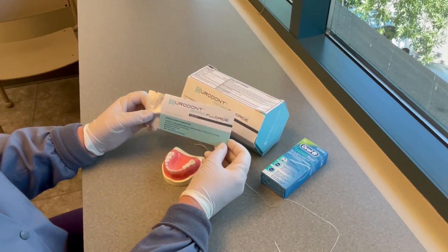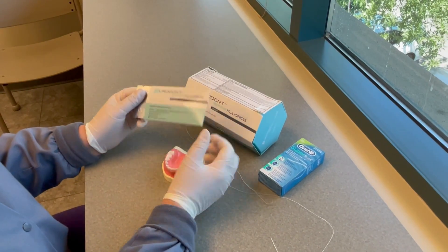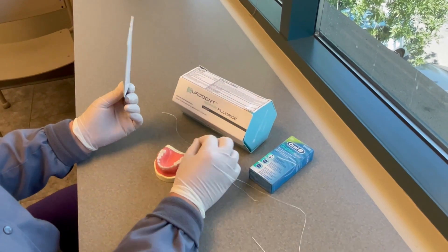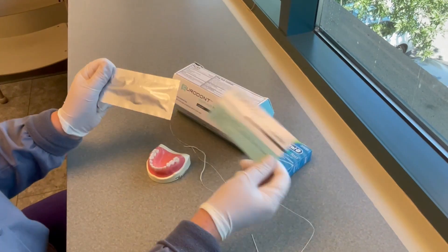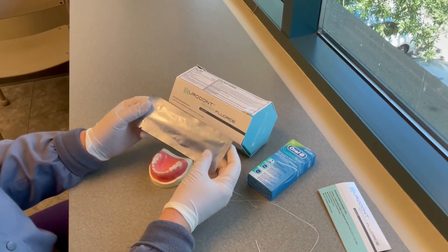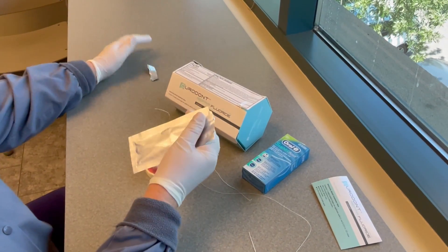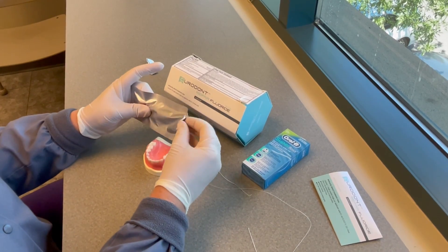The answer is yes, but it's very different from silver diamine fluoride or SDF, because it's not just about getting the liquid on the teeth. With SDF, you could put it on super floss or apply it with a microbrush. With this, the magic secret sauce — the peptide that is going to help remineralize the tooth — is actually in the sponge applicator. So that sponge has to contact the surface that you're treating.